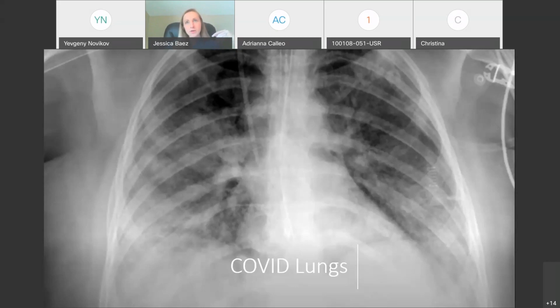What that means, though, is you'll see scattered areas of consolidation and normal lung and maybe some B-lines. So typically, lung ultrasound in COVID will have random distributions of all of those things that I mentioned, whether it's subpleural consolidation or scattered B-lines in different areas, accompanied by normal lung in other areas. It's just patchy all over, fairly consistent with COVID, okay?